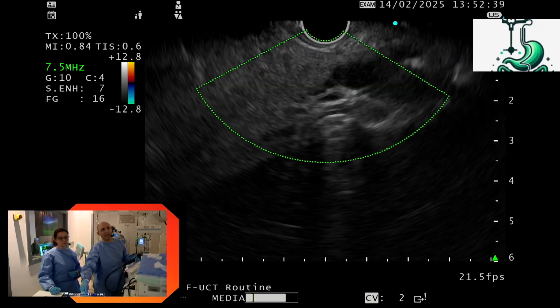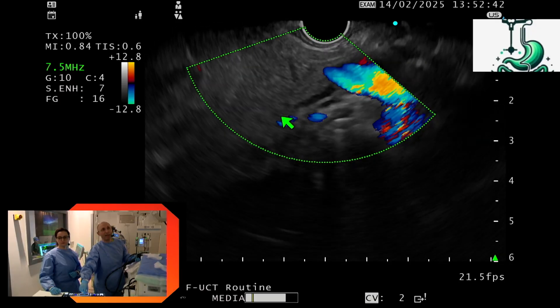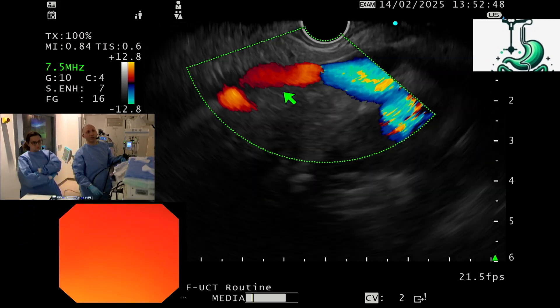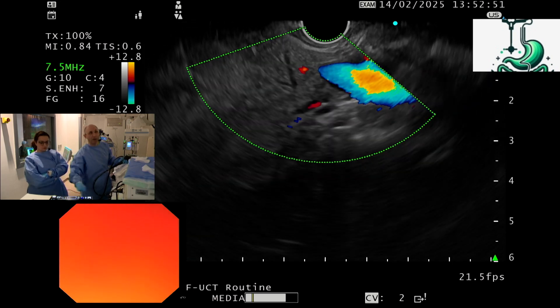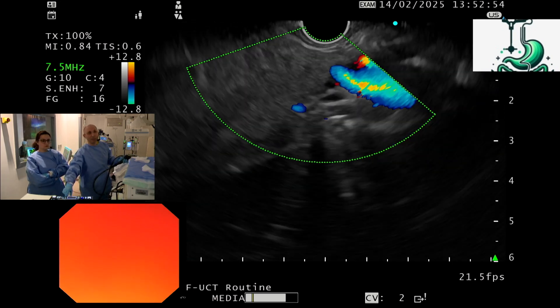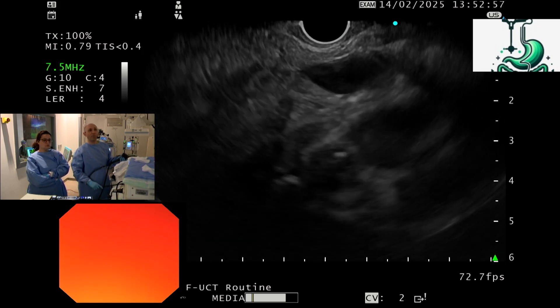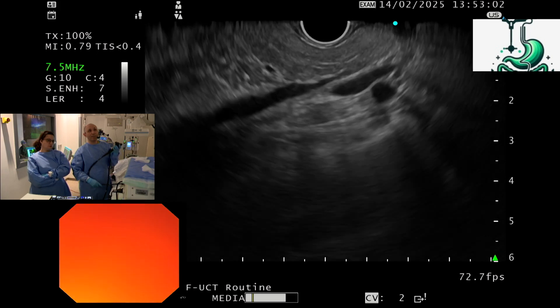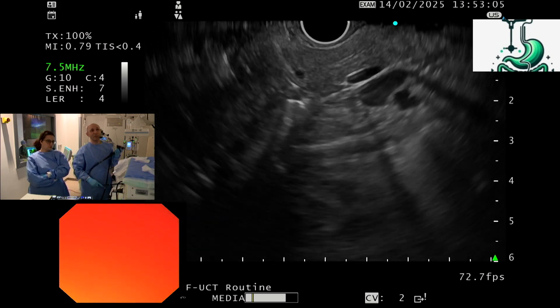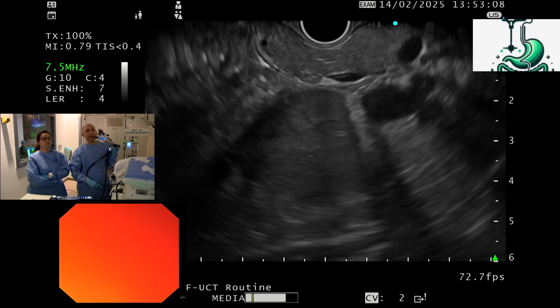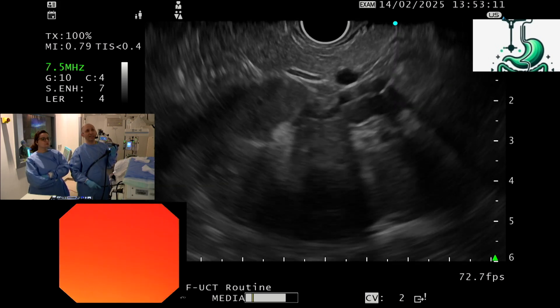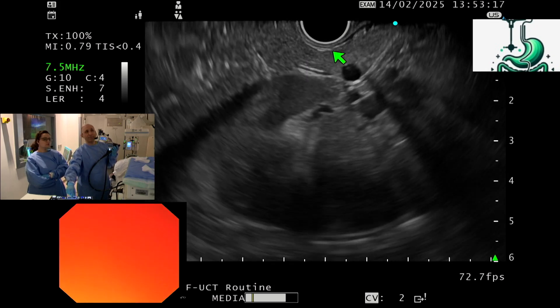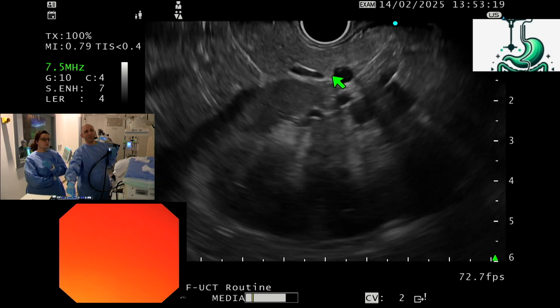Now we can see here the CBD and the pancreatic duct crossing toward the head of the pancreas. If I remove the Doppler and move to the body of the pancreas, we can see the pancreatic body with no features of chronic pancreatitis. Now the kidney is coming into the field at 6 o'clock. This is the kidney, this is the pancreatic body, and these are the splenic vessels — artery and vein.